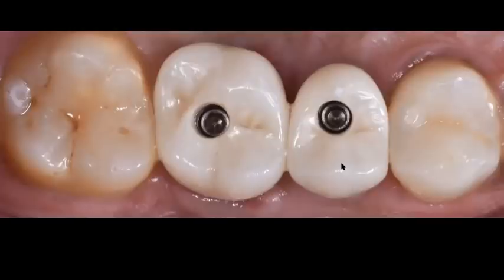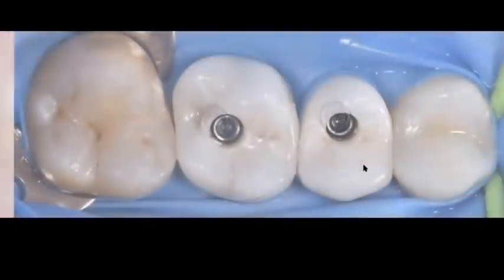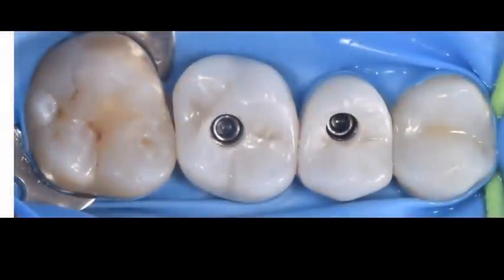So what I want to share with you is the way that I do this, just using the same concepts and techniques that I just shared with you. The only difference is the type of composite that we're going to use. We want to use a very opaque composite. So we want to use a dentin-like composite, if at all, a universal opaque dentin, so that we can hide that gray appearance of the metal.